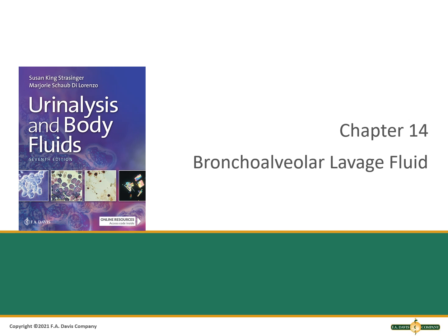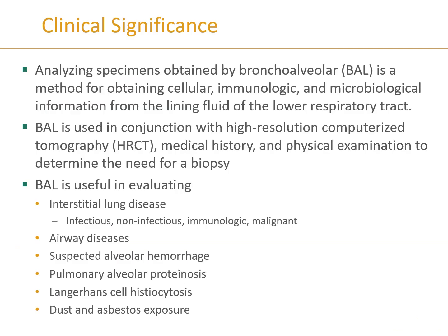For this lecture, we will cover the bronchoalveolar lavage fluid, also often referred to as a bronchwash. Analyzing bronchwash specimens helps us obtain cellular information, immunological information, and different microbial information that can be revealed from the lining fluid of the lower respiratory tract.